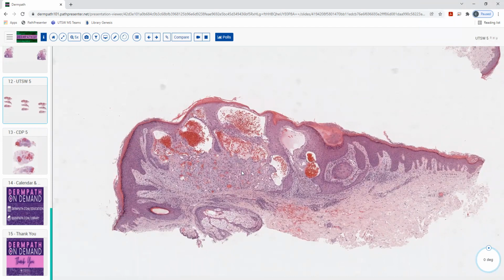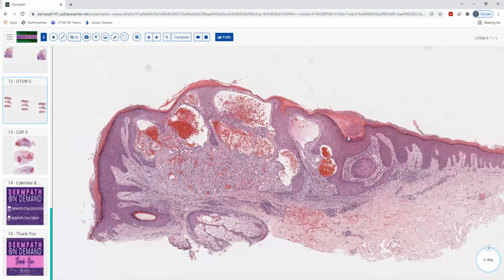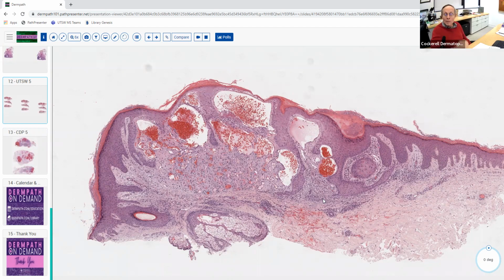Because I am seeing the kind of thinner vessels, seeing the clotting a little bit, and an increase, like the acanthosis of the epidermis. Good. There's overlying acanthosis. It almost looks kind of like a verruca, doesn't it? Good, excellent. Notice where all the vessels are. Where are all these blood vessels? In the papillary. Excellent. Papillary dermis. Usually, and that's where angiokeratomas really like to form. They're really involving the papillary dermis with the overlying verrucous epithelial hyperplasia, like you're seeing here, that you described quite nicely.